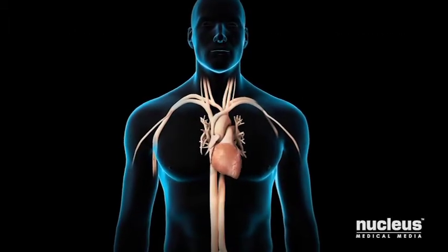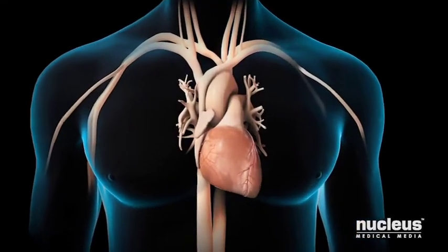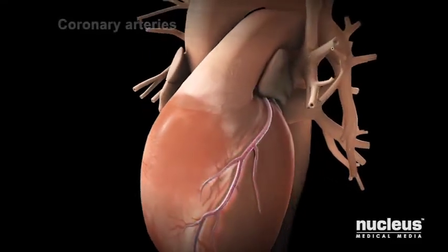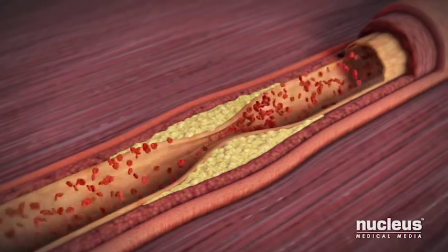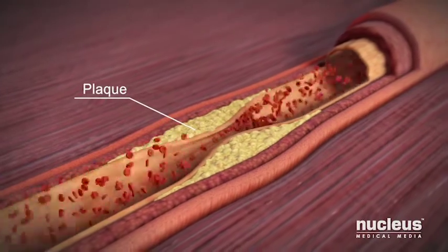If you or someone you know has recently had a coronary angioplasty procedure, this video will help you understand the steps of the procedure and how it restores blood flow to your heart. Coronary angioplasty, also called percutaneous transluminal coronary angioplasty or balloon angioplasty, is a procedure performed on blood vessels called coronary arteries that supply your heart muscle with oxygen. This procedure is designed to restore blood flow through coronary arteries that are narrowed or clogged by a buildup of a fatty substance called plaque.